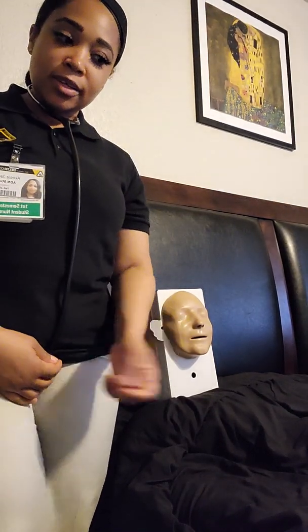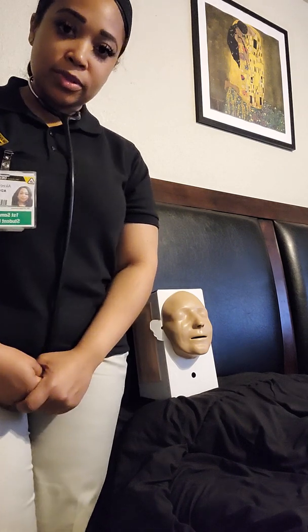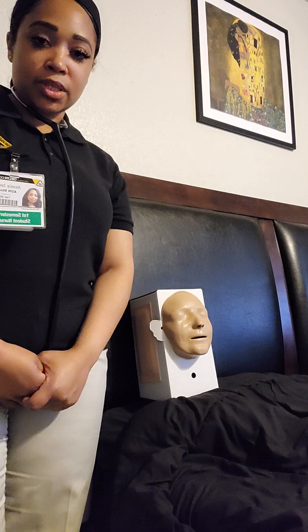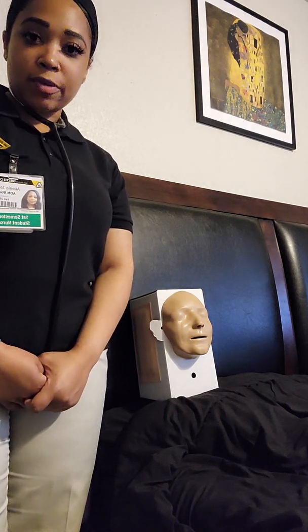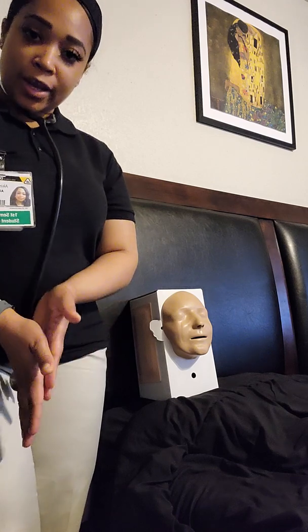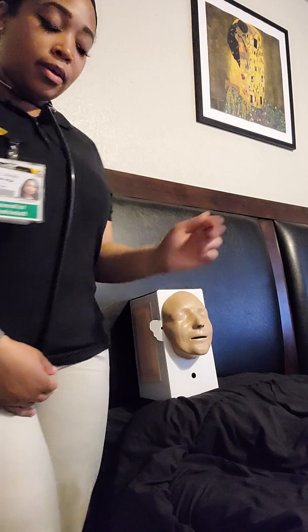I am Akila Jackson, and I'm going to be performing an NG2 insertion. So the first thing I will do is check the patient's chart, look at the order, and the reason why we are doing the NG2 insertion today, which would be for a bowel obstruction for this patient. I'm going to perform hand hygiene into the room, make sure there's adequate lighting, privacy, and so forth.